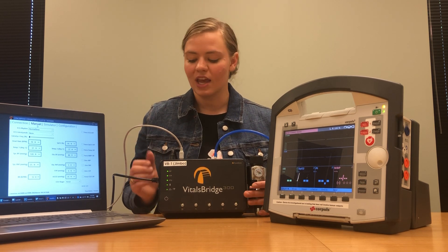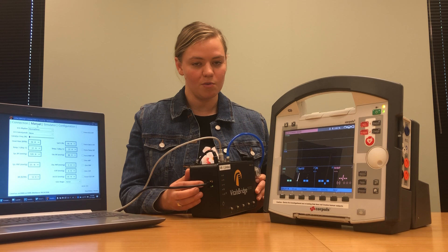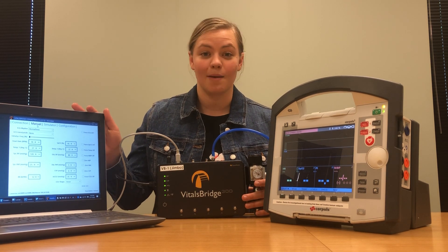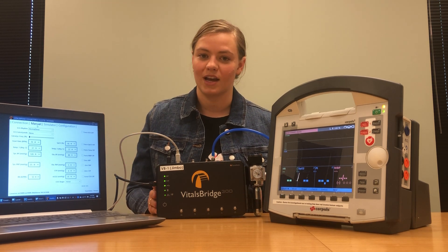If you're following along you're welcome to connect your VitalsBridge via a USB cable, which is plugged in right here, or an Ethernet cable, which is plugged in right here — both cables plug directly into your laptop. You can also use Bluetooth, which is configured the same way any Bluetooth device would be configured.